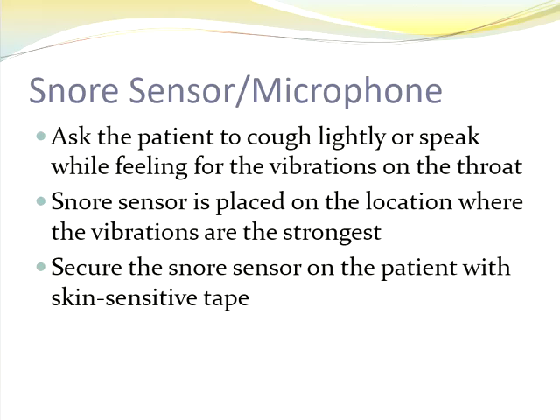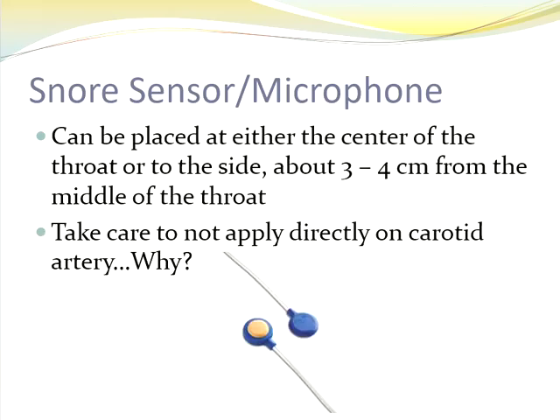It doesn't matter what side of the neck that you put this one on either, but I always take care to put it on whatever side I am bringing all my wires to. So you guys remember in the lab when we started applying the body wires, all the wires tended to come to one side, and that makes it easier to bundle them together so they're more secure, patients less likely to trip on them or get tangled up in them. So I just bring this one to whatever side I already have all the wires on anyway.